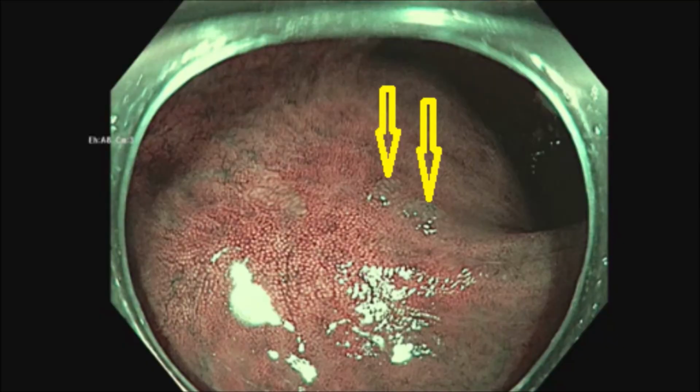Here we see arrows on these 2 tiny areas of SSL recurrence, and this emphasizes the importance of inspecting the entire EMR scar very carefully because, of course, we want to identify every visible recurrence and treat it endoscopically at the time of follow-up. So use electronic chromoendoscopy, use magnification when available, and inspect the entire scar carefully.